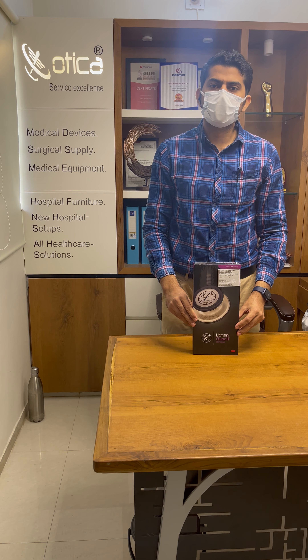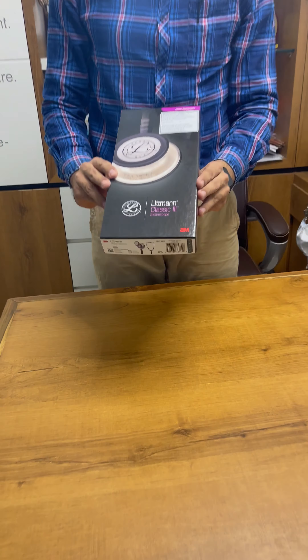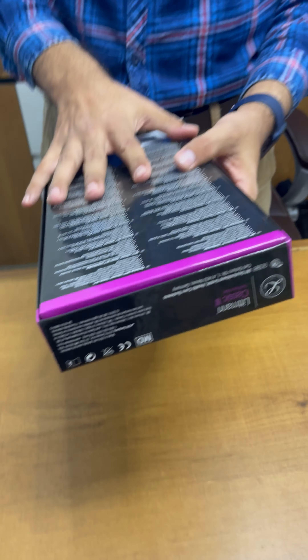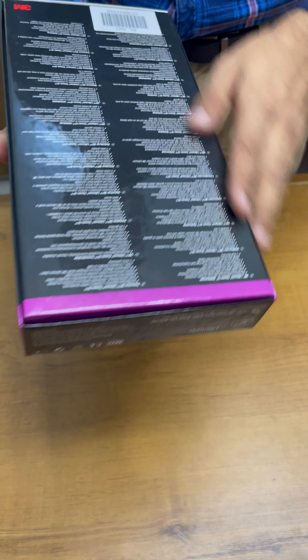Hello friends, welcome to Otica Meditronics company. Today we are going to unbox the Littmann Classic 3 stethoscope. We have just purchased a new one and you can see the device has no seal provided by the company anywhere.